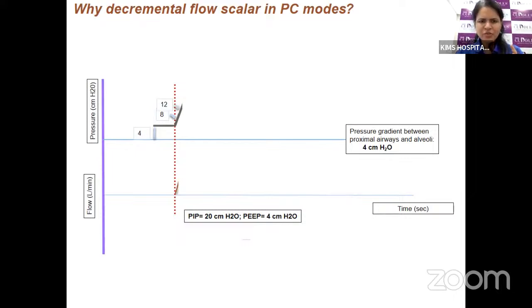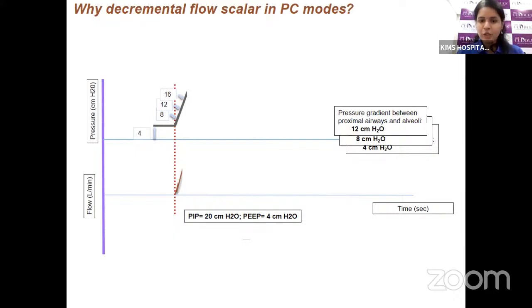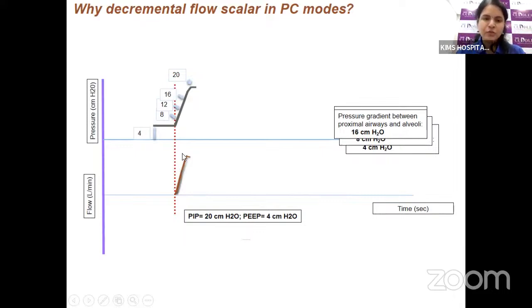So this delta P, or the pressure gradient, drives a very rapid inflow of gas during the beginning of inspiration. So the flow rapidly increases, as you can see in the second curve here, because the pressure differential is maximum at the beginning of inspiration. So this drives the maximum of the peak inspiratory flow rate.